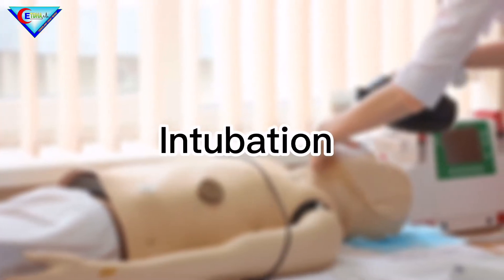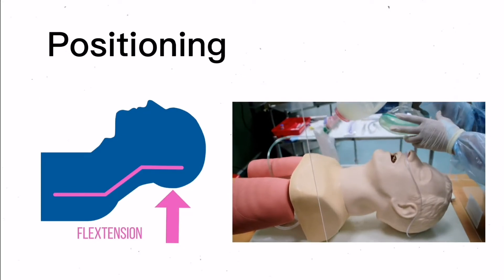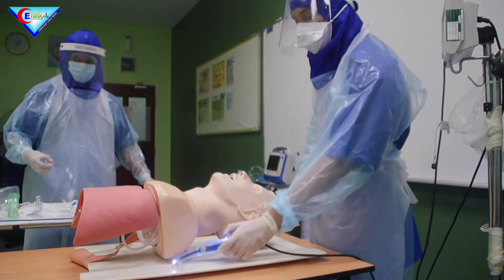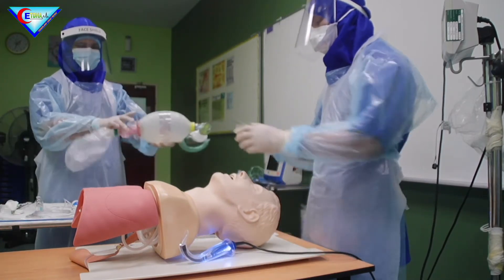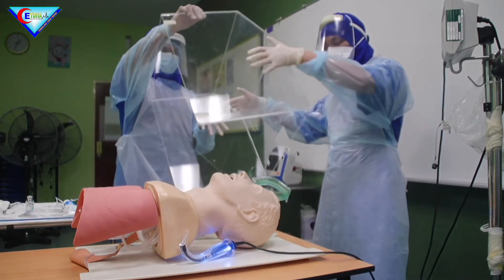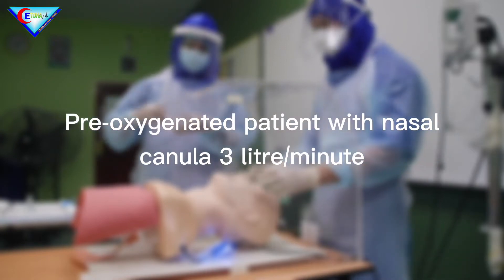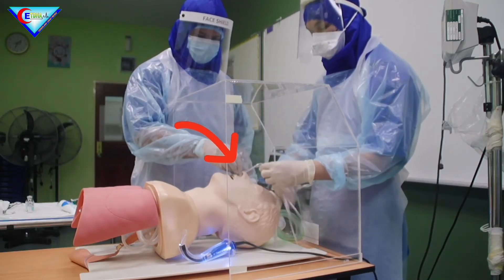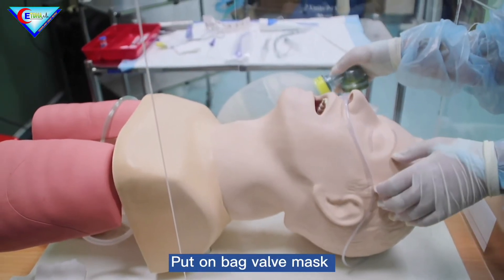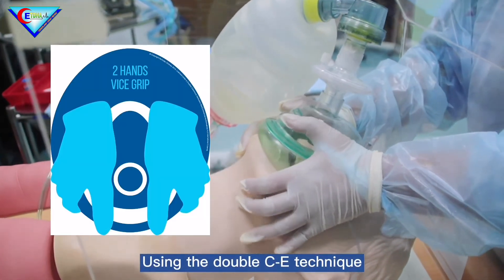Before intubating the patient: insert in the box — video laryngoscope, ETT with attached stylet, and bag valve mask. Apply intubation box. Pre-oxygenate patient with nasal cannula at 3 liters per minute. Then apply bag valve mask and set oxygen at 10 to 15 liters per minute, ensuring tight seal using double C-E technique clamp.